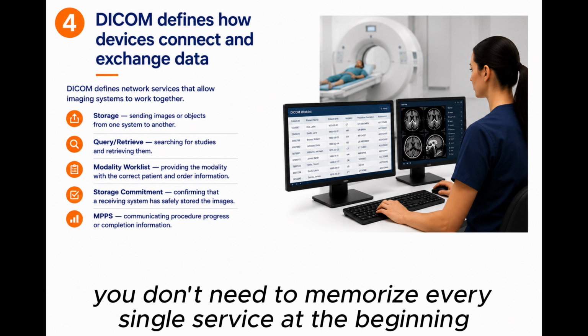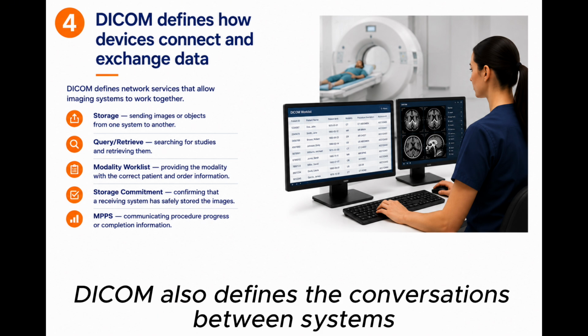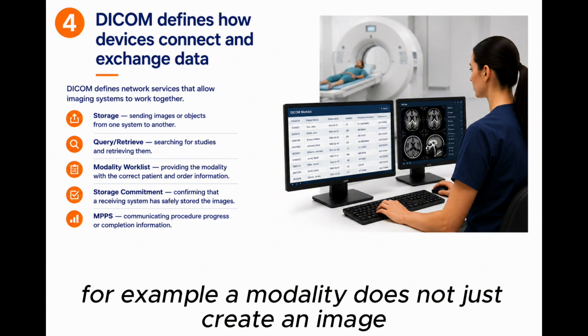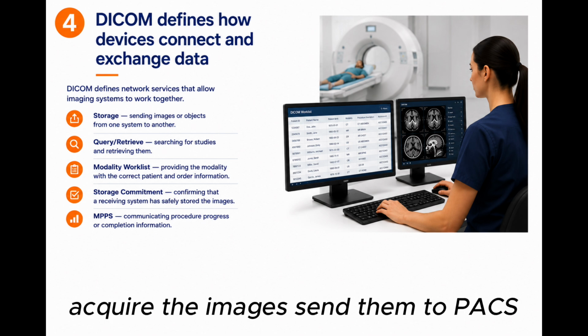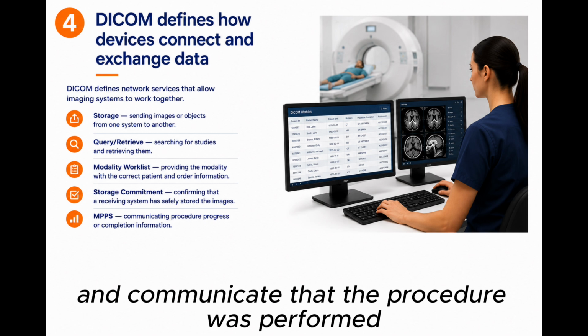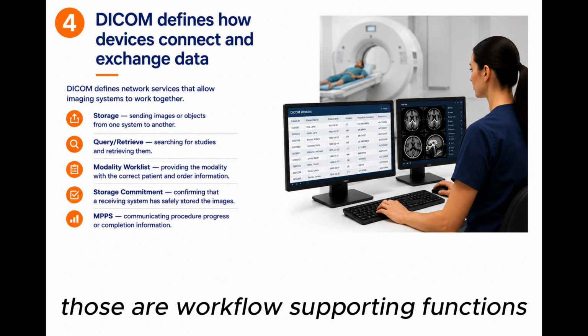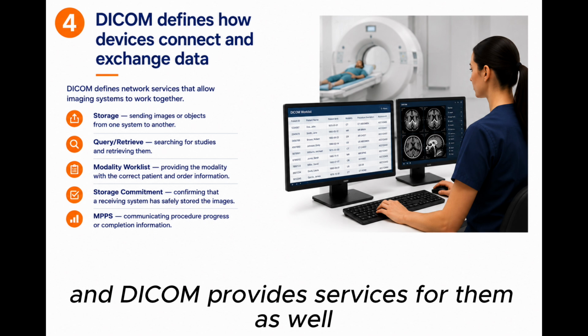You don't need to memorize every single service at the beginning. The key concept is this. DICOM is not just the object being sent. DICOM also defines the conversations between systems. For example, a modality does not just create an image. It may ask for a worklist, acquire the images, send them to PACS, confirm that PACS stored them, and communicate that the procedure was performed. Those are workflow supporting functions, and DICOM provides services for them as well.